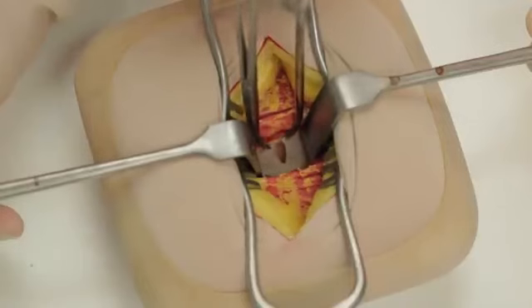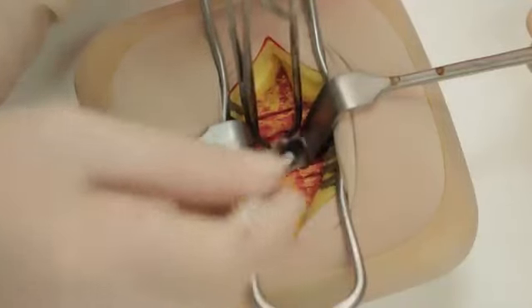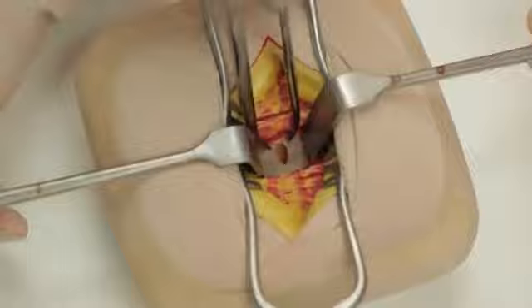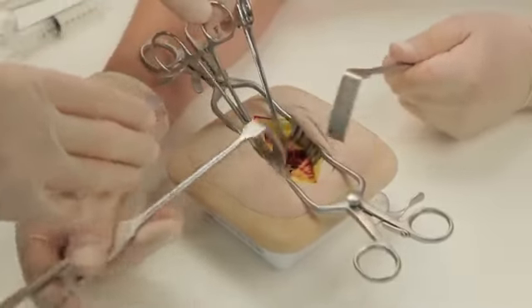If there is free fluid or pus, take a swab, or alternatively collect a sample of fluid using a syringe. Look for any bile-stained fluid which may indicate a perforated peptic ulcer. Identify the cecum via Taenia coli and follow these to the base of the appendix.